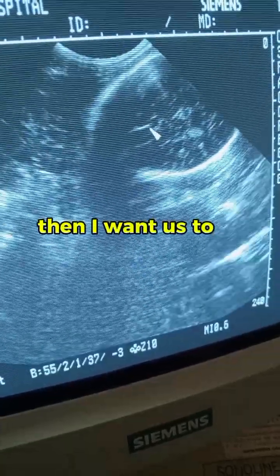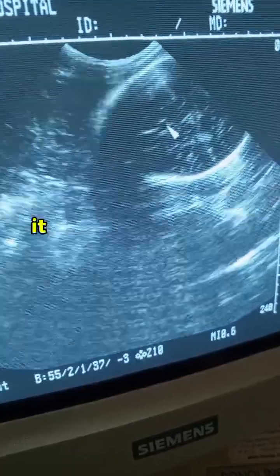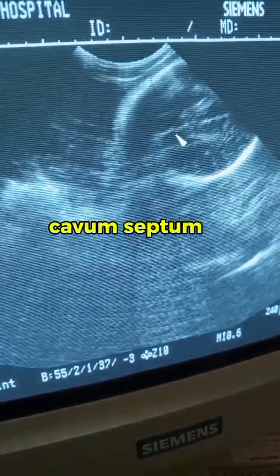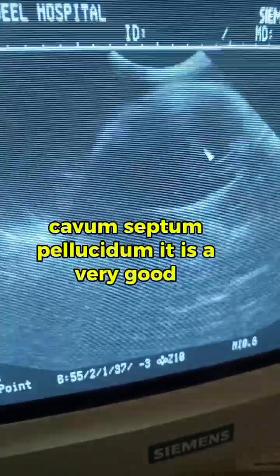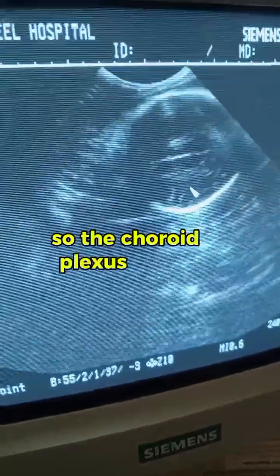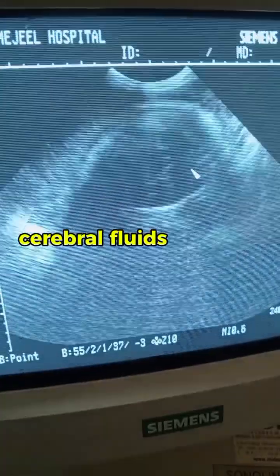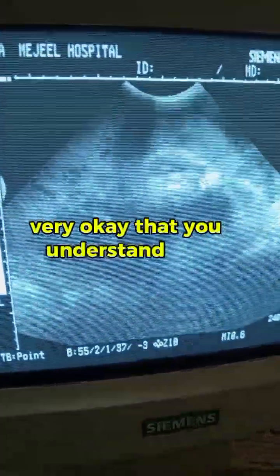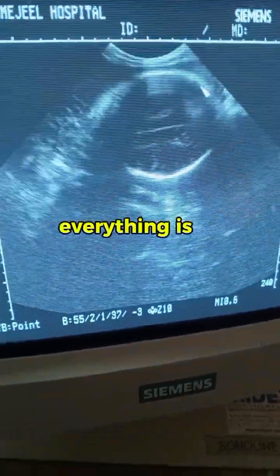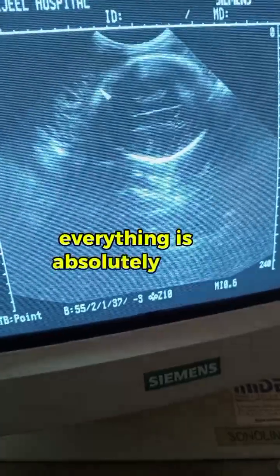Then I want us to look at this anechoic area here. This area that this caliper is pointing at is known as the CSP, cavum septum pellucidum. It is a very good indicator that the baby is fine. The choroid plexus produces the cerebral fluid. It's very important that you understand the anatomical structure. Then you look at the cranial vault. Everything is complete here, as you can see. Everything is absolutely fine.